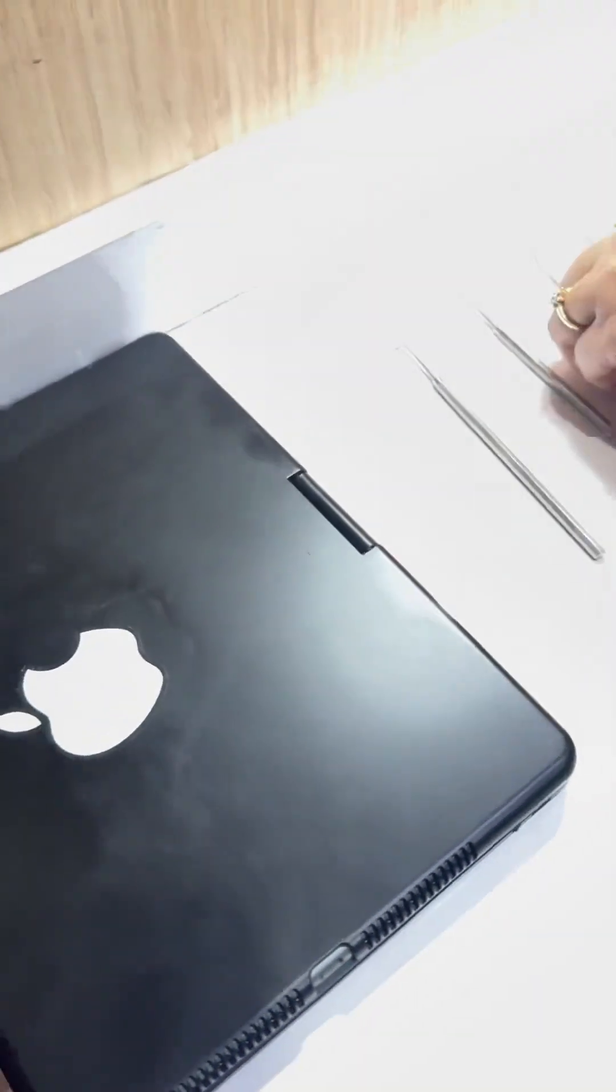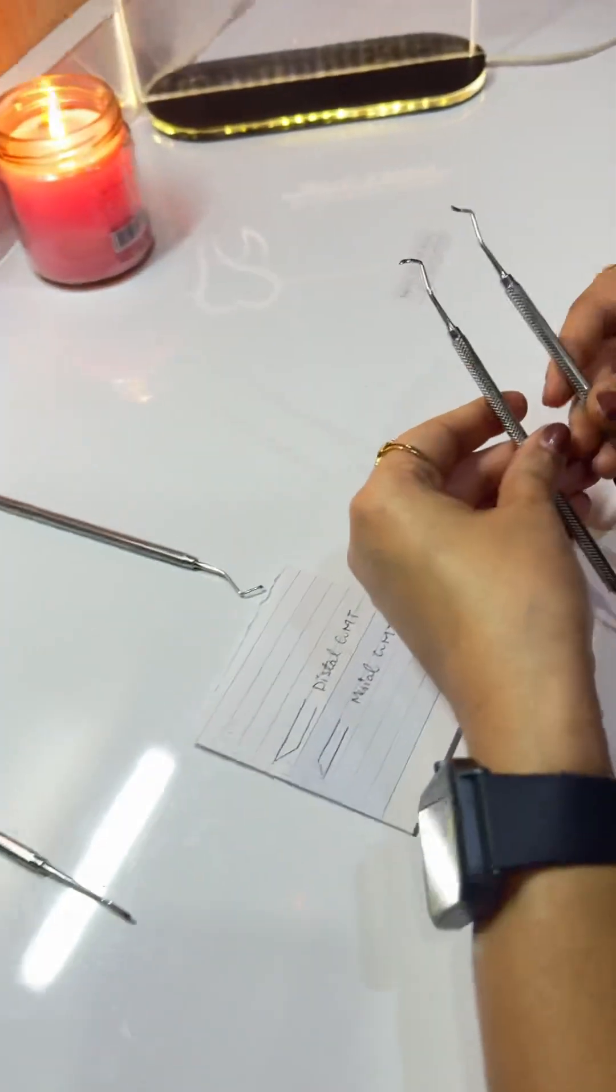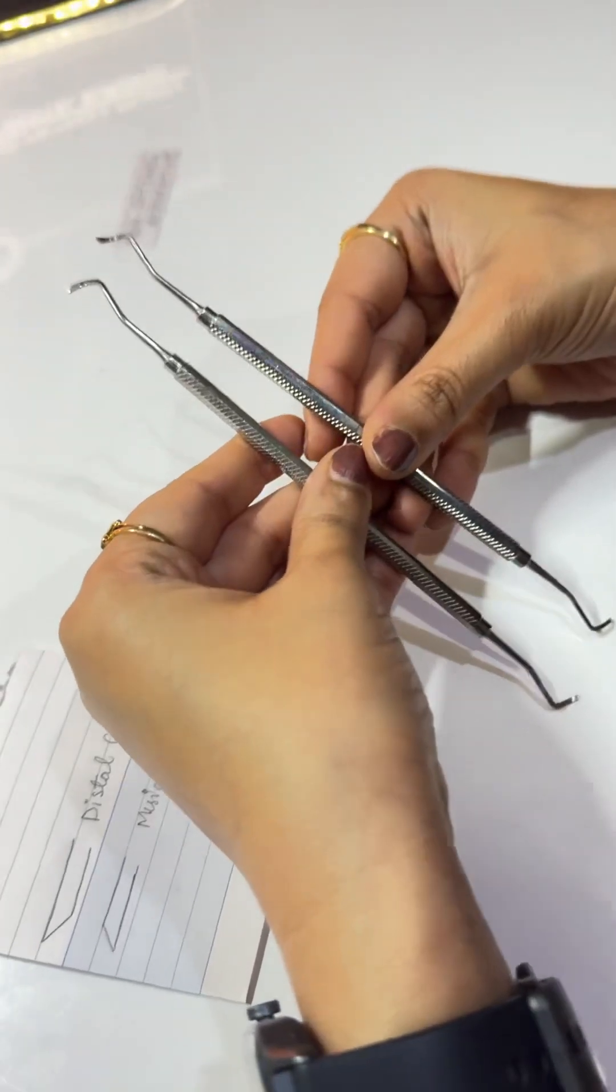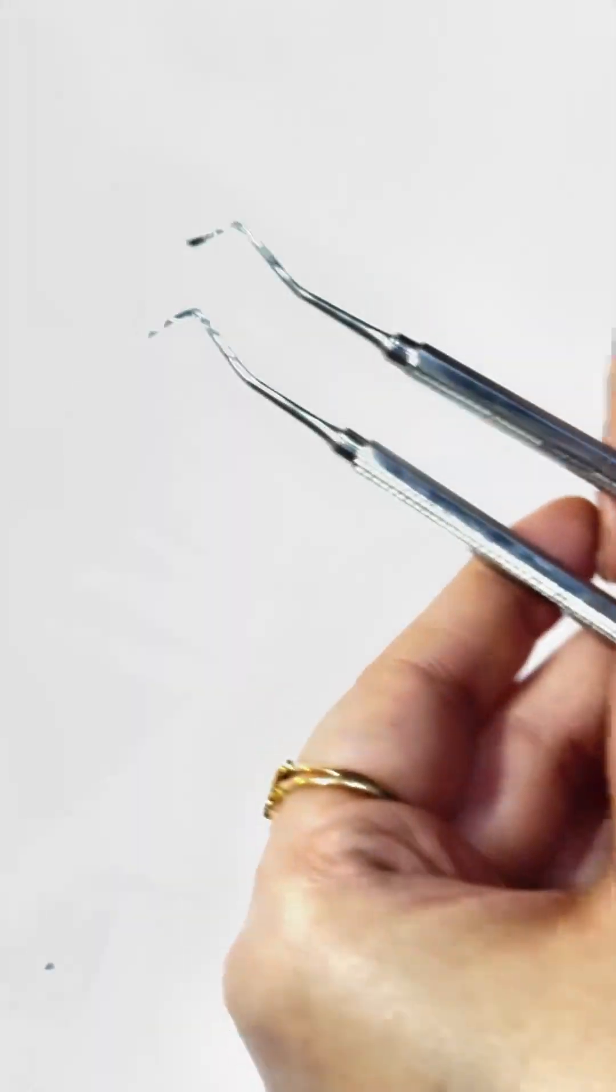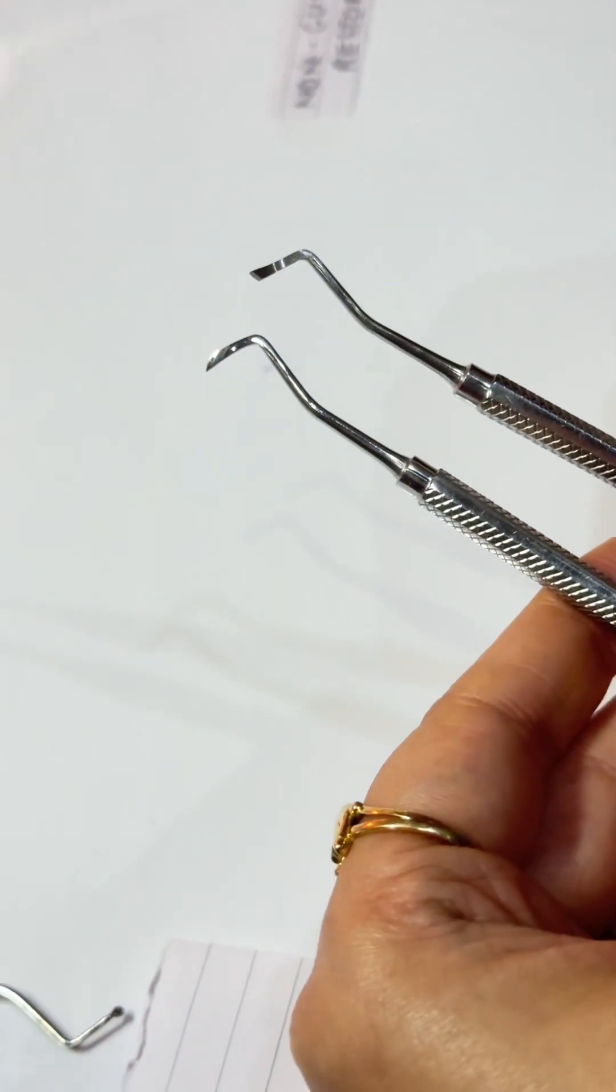Now the next instruments, these are GMTs. See the cutting edge. This is the GMT, the gingival marginal trimmer.